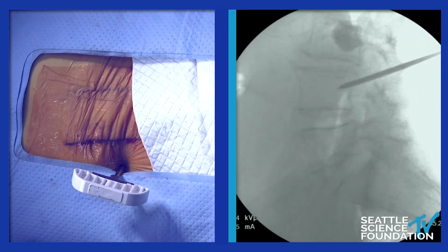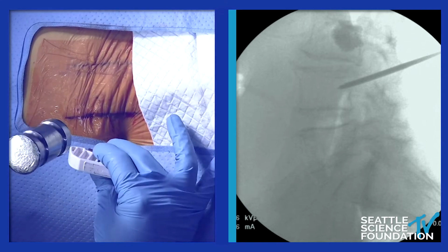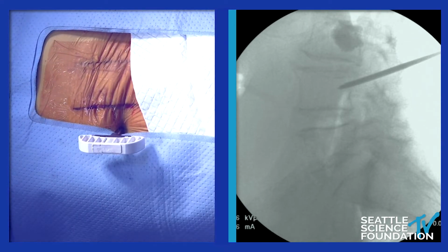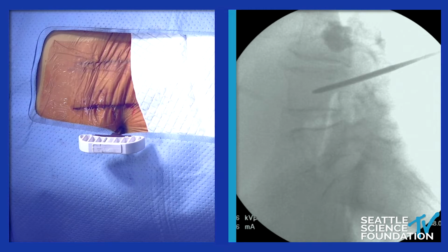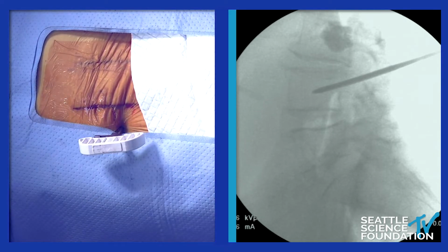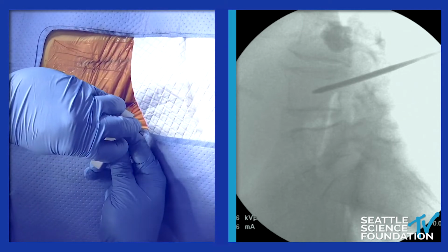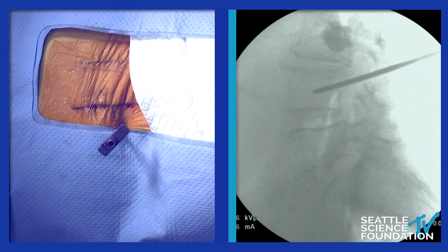But Glenn, aren't you angling too far inferior, right? Or is that where you want to be on this one? That's a decent approach, but it also depends, of course, where the actual tumor is. So you're right in the center of the vertebral body there. Okay, great. At this point, we're coring it out.